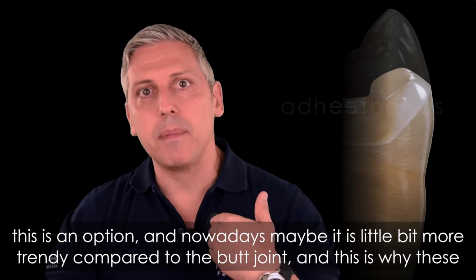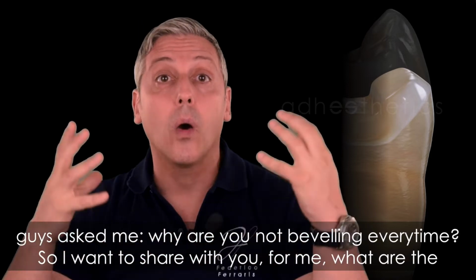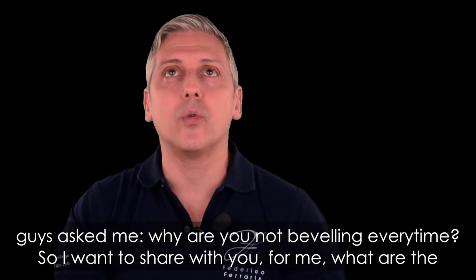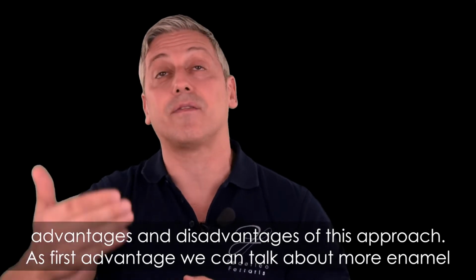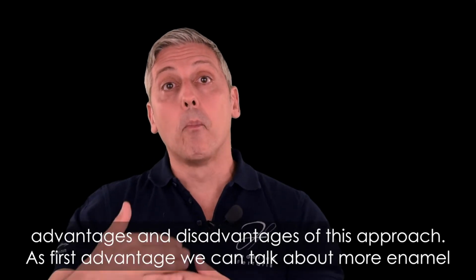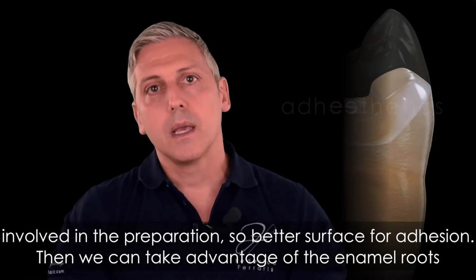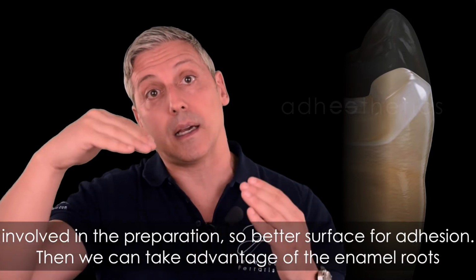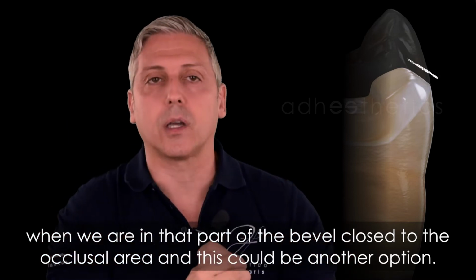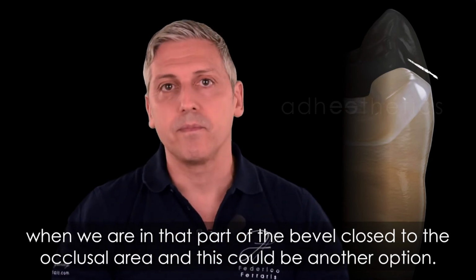Nowadays it is maybe a little more trendy compared to the butt joint, and this is why these colleagues ask me why I am not beveling every time. So I want to share with you what, for me, are the advantages and disadvantages of this approach. As a first advantage, we have more enamel involved in the preparation, so a better surface for adhesion. Then we can take advantage of the enamel rods when we are in that part of the bevel close to the occlusal area.